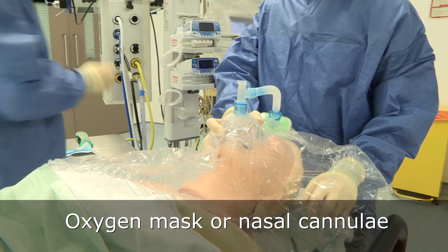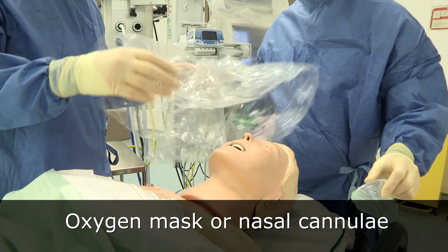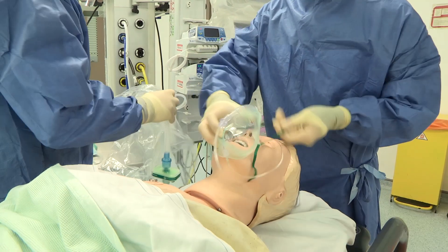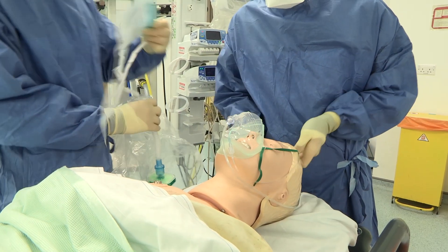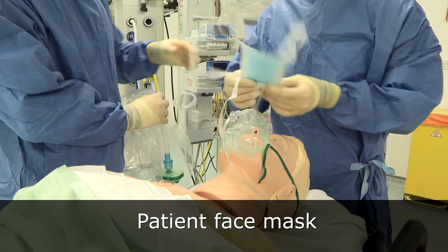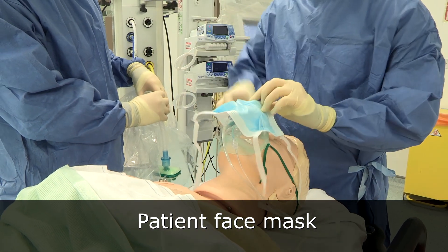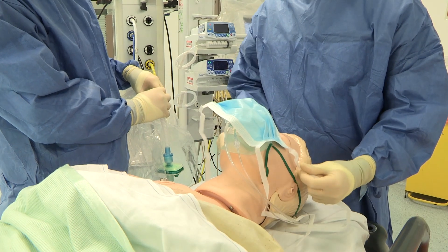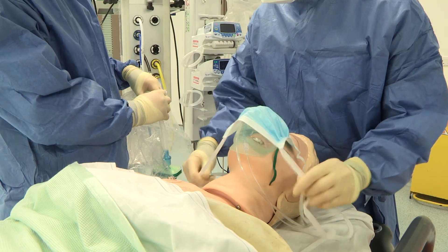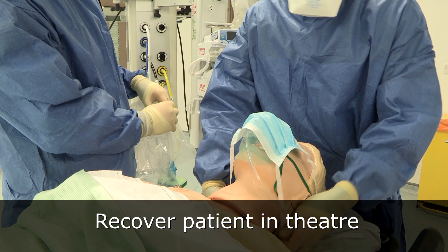And then we'll have the surgical face mask. You can pass me the mask when you're able. Thank you very much — put a surgical mask or face visor over the patient. Saturations are good. The patient is recovered in theatre.